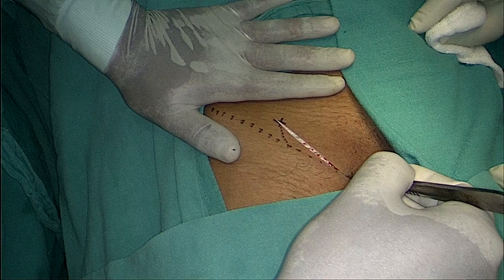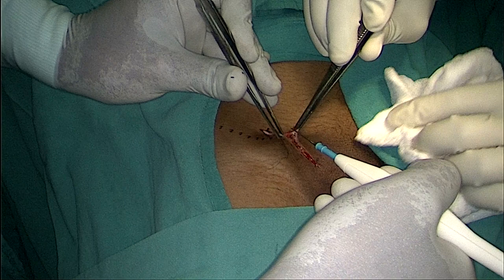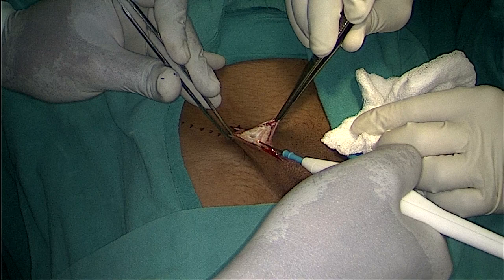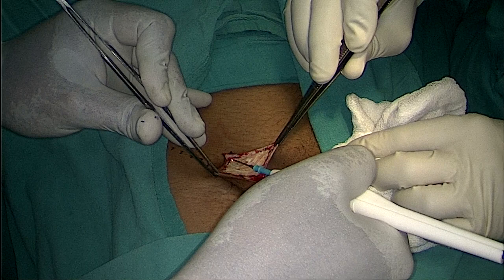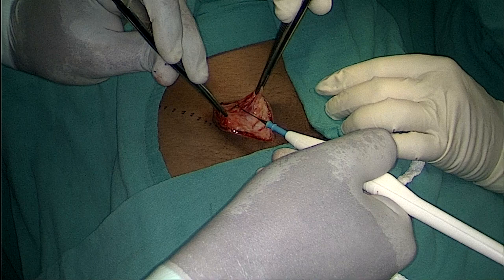Now we start giving the incision from the deep inguinal ring to the superficial ring, cutting the Camper's and Scarpa's fascia with the subcutaneous tissue. Now we are holding the skin and cutting the subcutaneous tissue. Try to maintain hemostasis as much as possible in the early stages. Now we are holding the subcutaneous tissue and start cutting down Camper's and Scarpa's fascia.